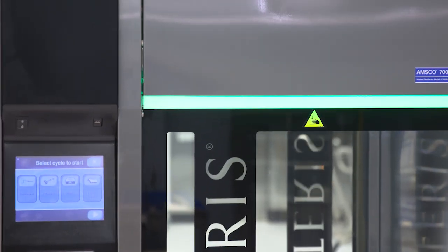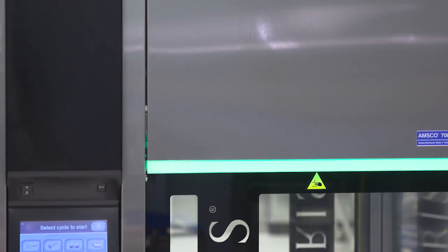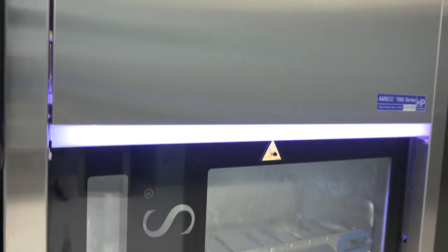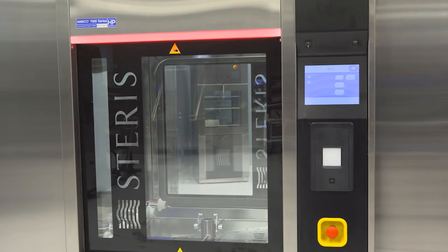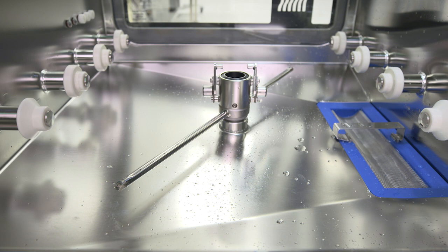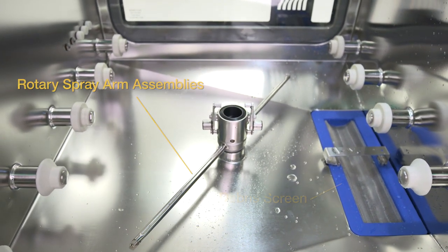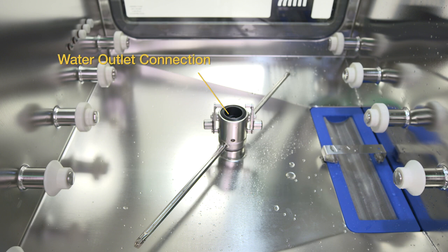The washer is equipped with lighting showing cycle status. Green indicates the washer disinfector is available. White indicates the washer disinfector is in cycle. Red indicates the washer disinfector needs attention. Inside the chamber are the rotary spray arm assemblies, a debris screen, and water outlet connection.